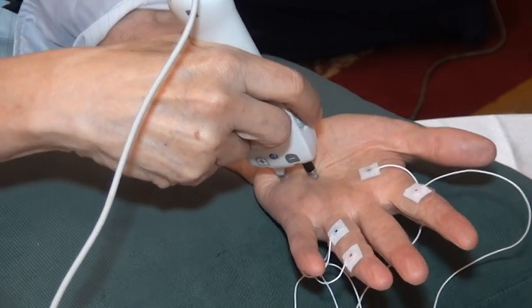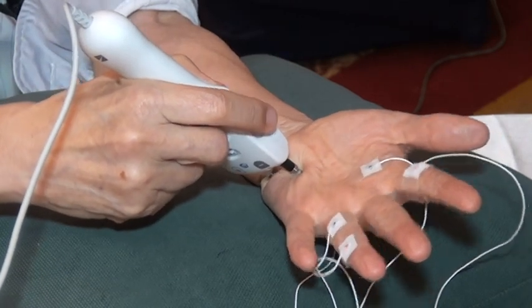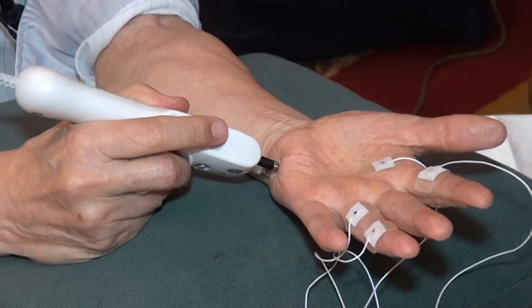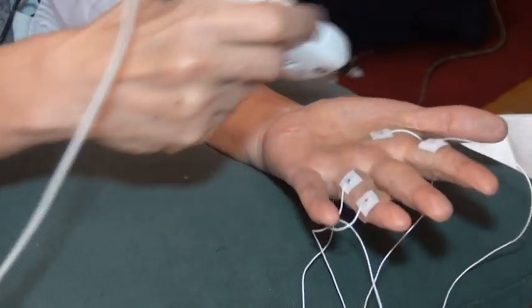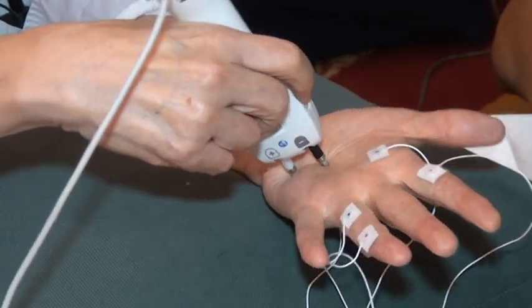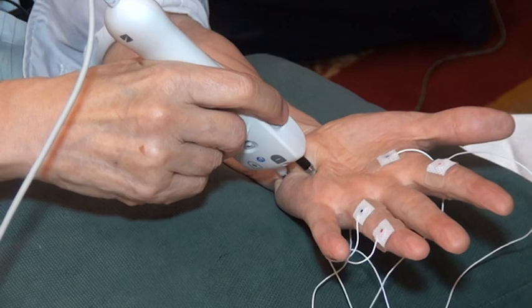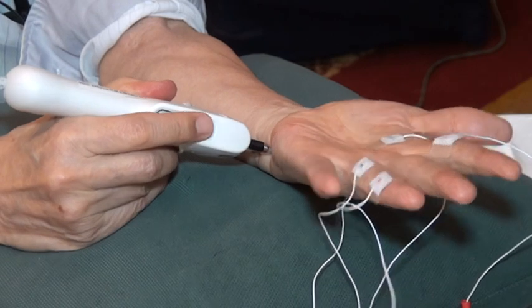Stimulus output. This is not the ideal place to do it. Stimulus output is a little too much. Okay. Well, let's start from the beginning. I think I need to control the stimulus output a little bit if I can. Maybe I cannot. Okay, let's start. Okay, take that. Take that. Take that. Take that.